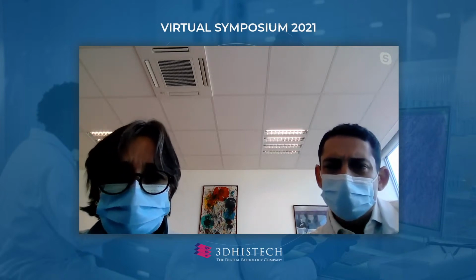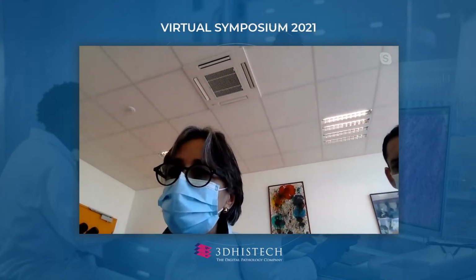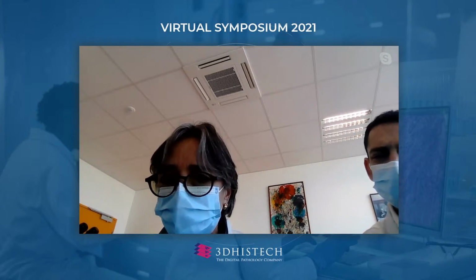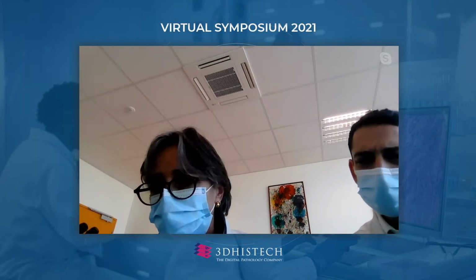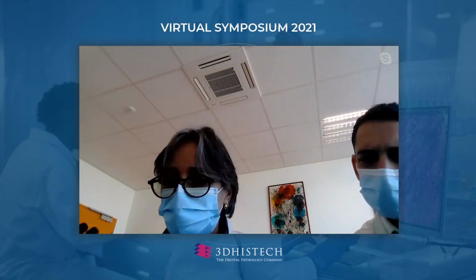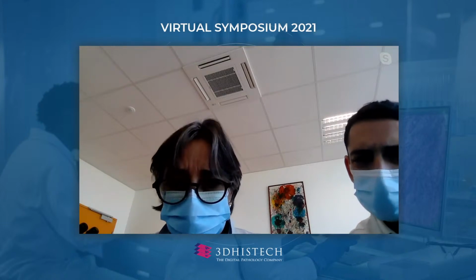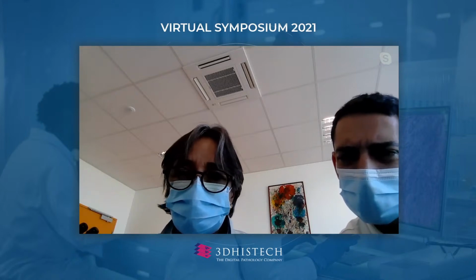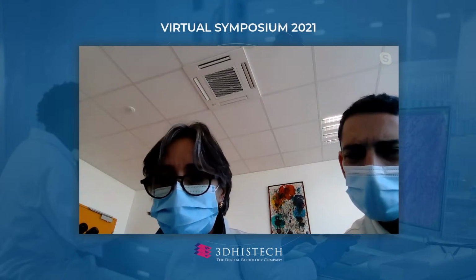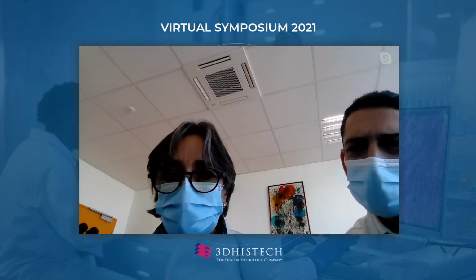What does fully digital pathology mean? From my own perspective, I think it means that all the slide production of the laboratory is digitized, and maybe that more than 80% of the pathologists read their cases only on digital slides. And in the future, of course, it will include the use of AI algorithms. But for the moment, I mean all the slide production being digitalized.